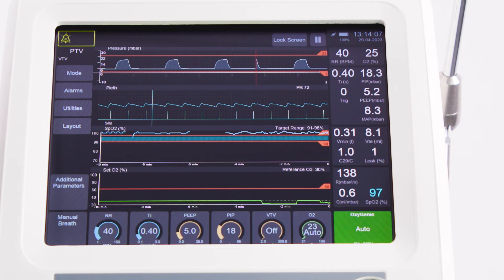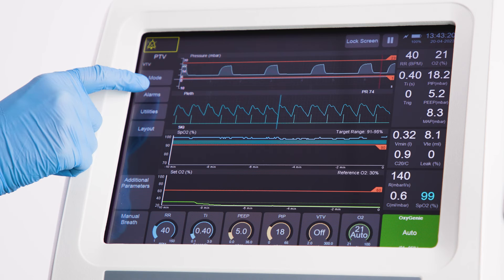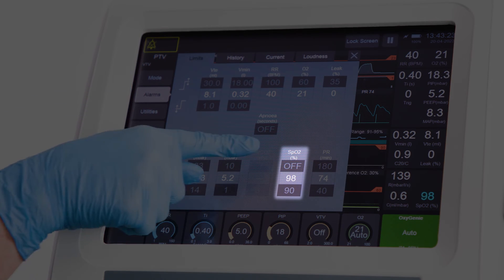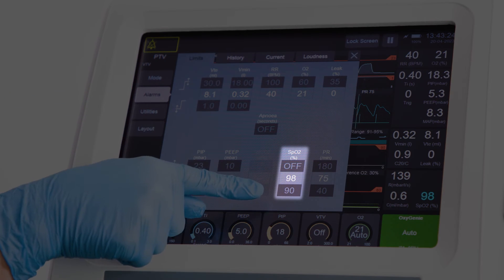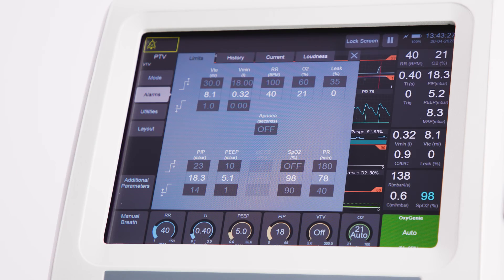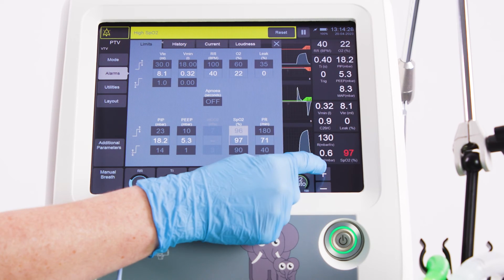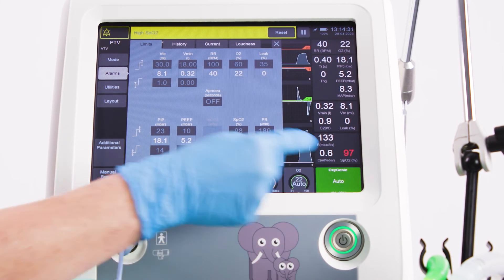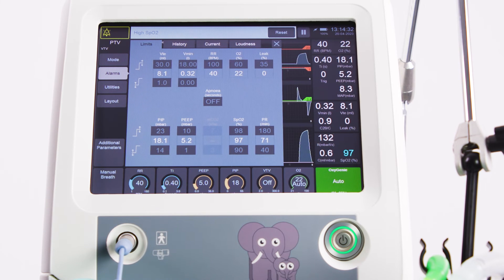When first enabled, Oxygeni has default high and low SpO2 alarm limits. These are enabled respectively at 1% above the high limit and 1% below the low limit of the target range. The user can choose to override these values and enter their own alarm values in the alarm panel.